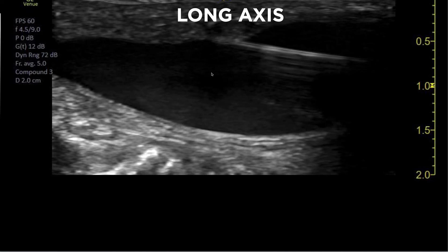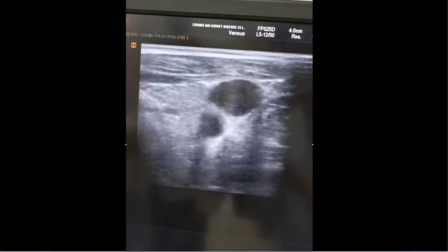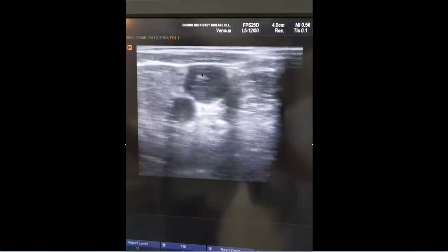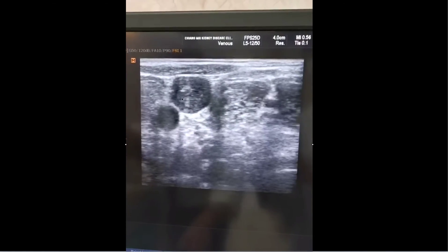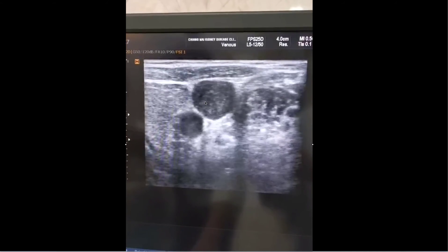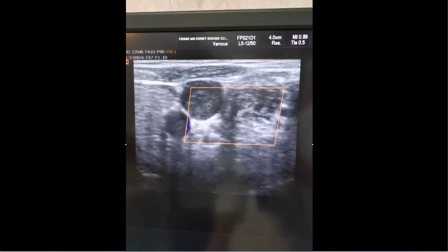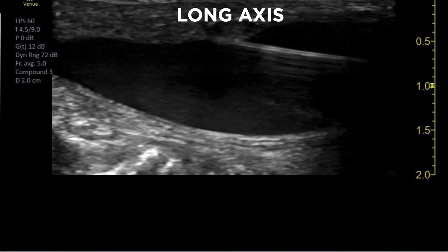This is a good way to confirm the wire is in the jugular vein before you put in any dilators. This clip is really from my resident — it's a great one. As you can see, this is an obstructed jugular vein with clot visible everywhere. If you see this first, you don't bother to put in any wire or needle.